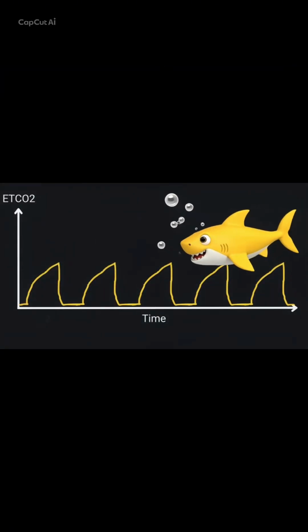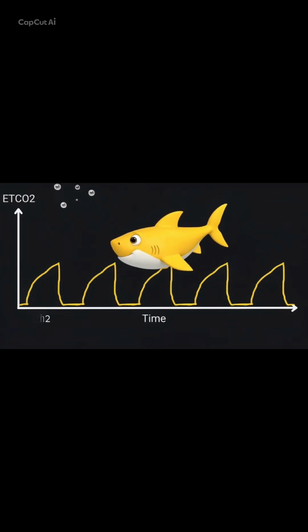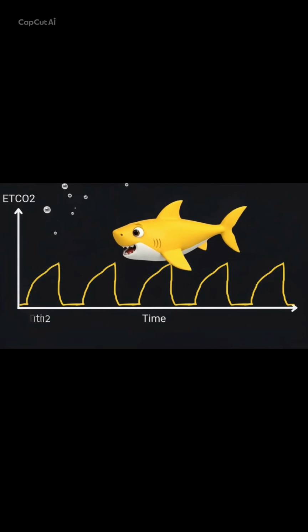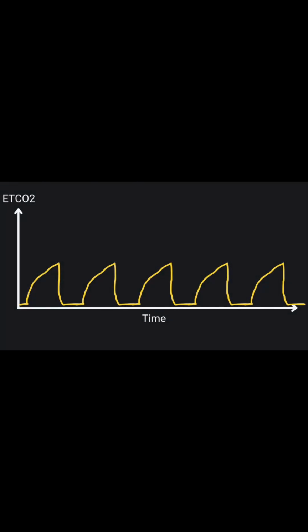One of the most recognizable capnography waveforms is the shark fin. So you can imagine a patient having a severe asthma attack. Instead of a rapid rise and flat plateau, expiration becomes prolonged. So that means the upstroke becomes slanted. The plateau slopes upward instead of remaining flat. The waveform literally looks like a shark's fin.